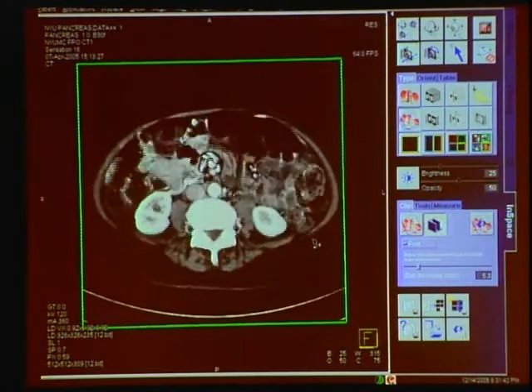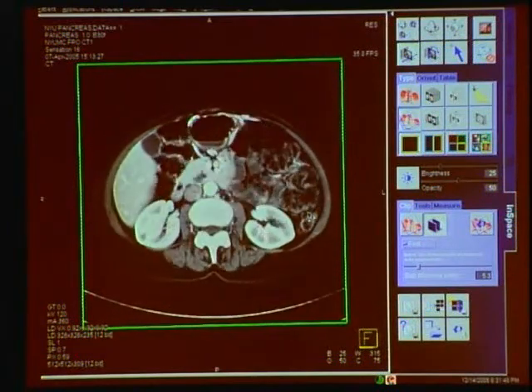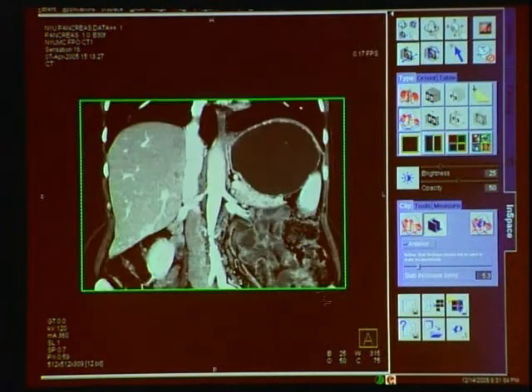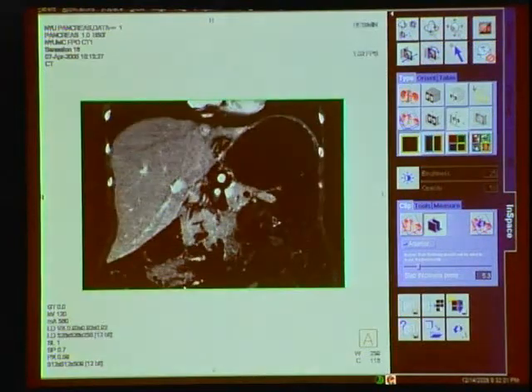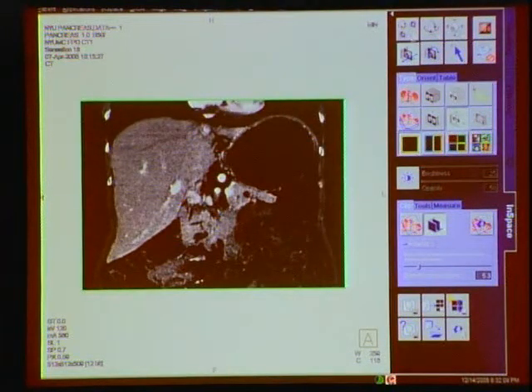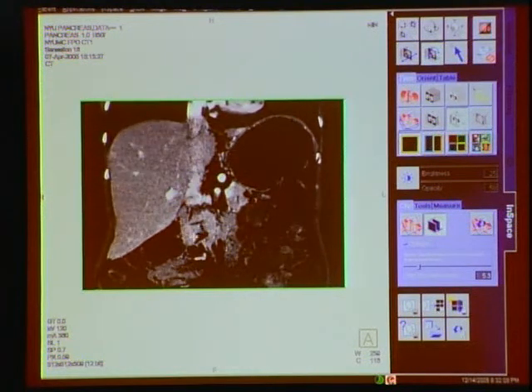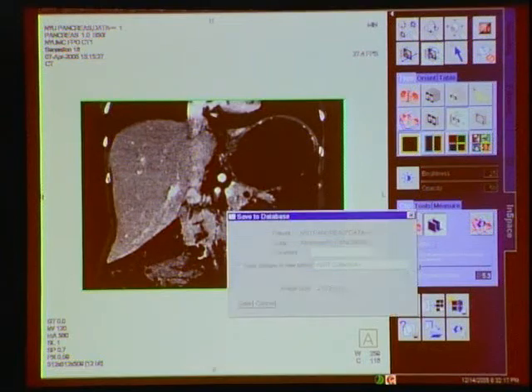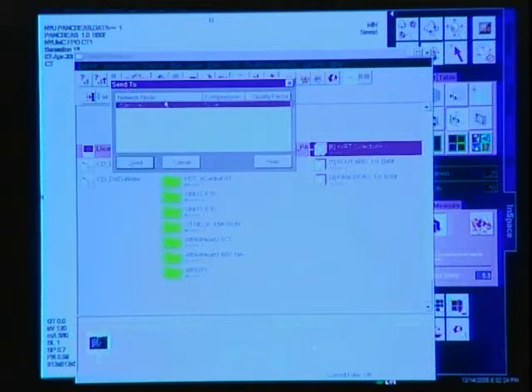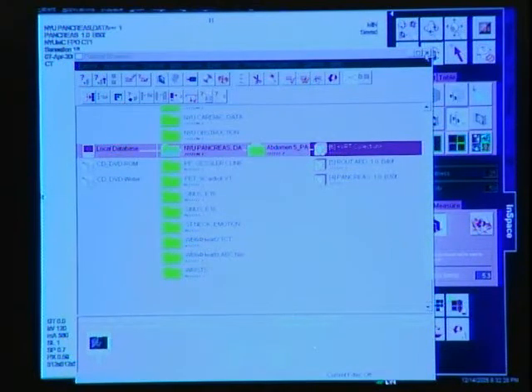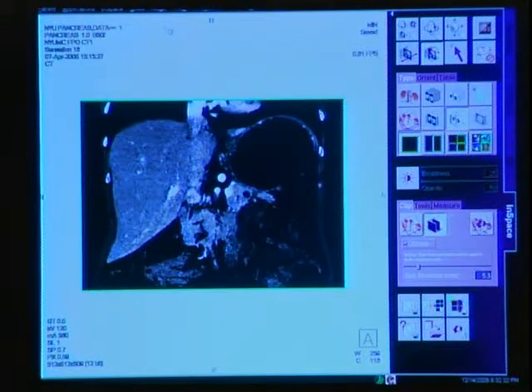We can examine the data set very nicely, and as we look, there's a cystic abnormality right there in the pancreas. We have an interactive data set, so we can come back to the anterior plane and localize that. We can change to a mini-MIP very easily, and by rotating the image, we can actually show very nicely the communication of this IPMT to the main pancreatic duct and make a diagnosis. We take a picture, save it, go back to the browser, send it off to PACS — and it's all done. It really doesn't take much time, and it leverages the type of data you collect for just this reason.